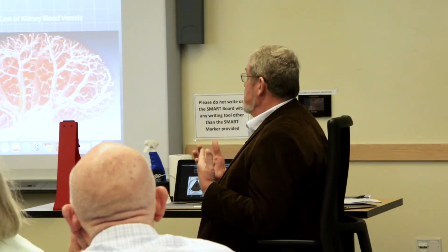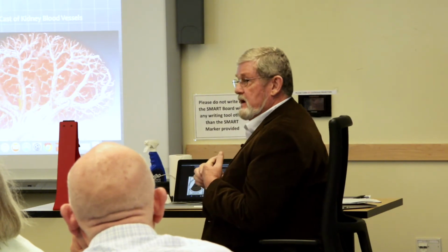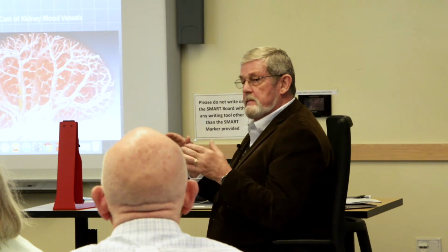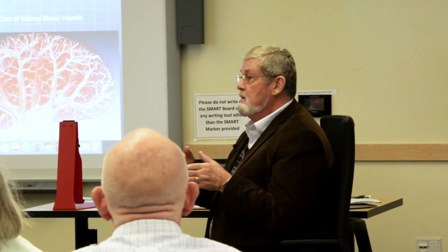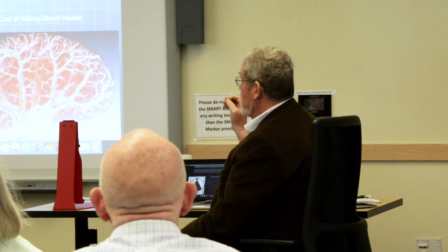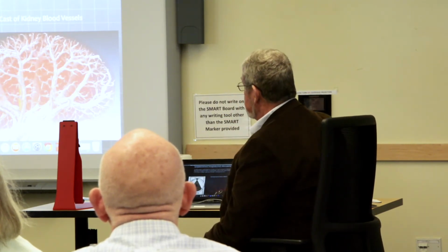Another way of getting 3D information is by computerized axial tomography. This is based on using X-rays, which are scattered or absorbed as they go through a specimen. Bone is one of them. They pass through an object. A tomographic series results from rotating this X-ray source around a specimen.